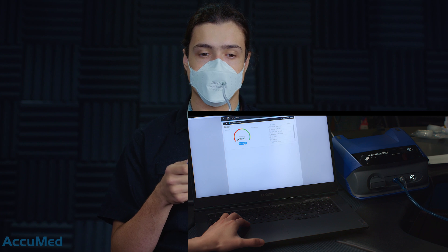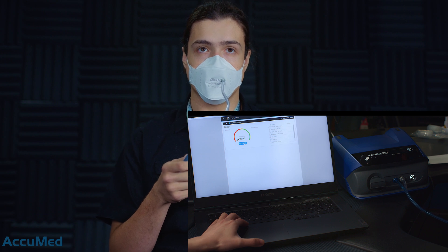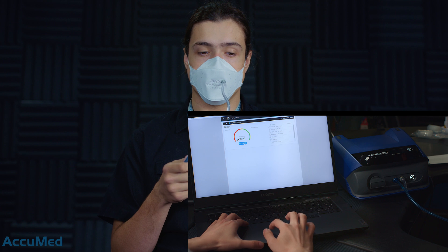Hello everyone. We are here testing the BNX F95 white model with the TSI PortaCount testing machine. Now let's go and start the test.